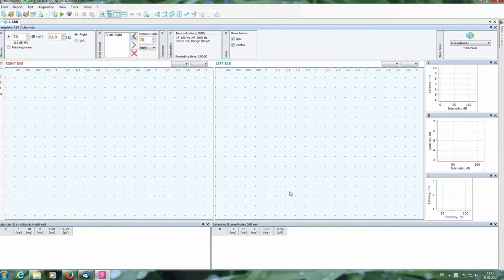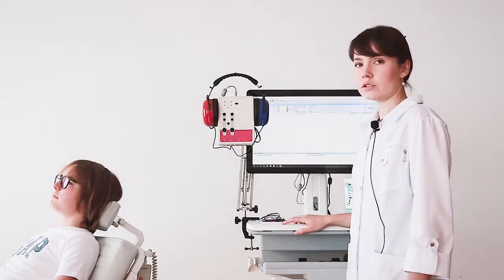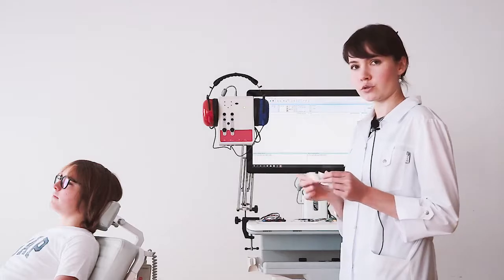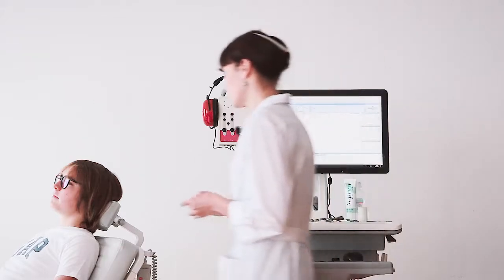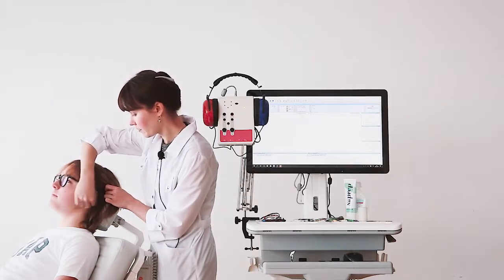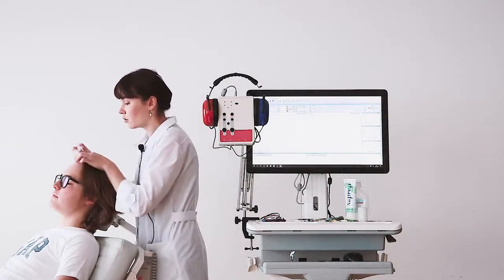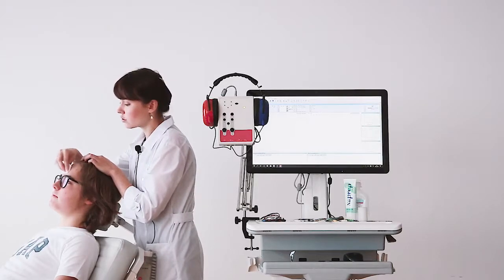Now we are in the main program window for this test. We are ready to put on the electrodes. Before that, we need to prepare the patient's skin properly. Firstly, we need to degrease the electrode positions, especially if the skin of our patient is oily. We degrease the skin behind both mastoids, where we will put the active electrodes, and the skin on the forehead, on the high forehead and on the low forehead.